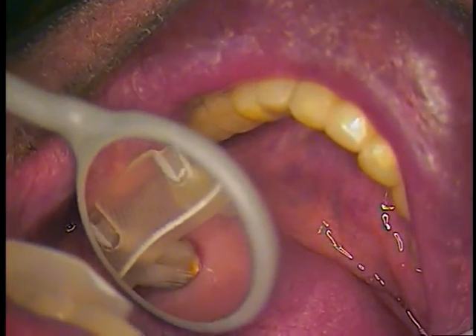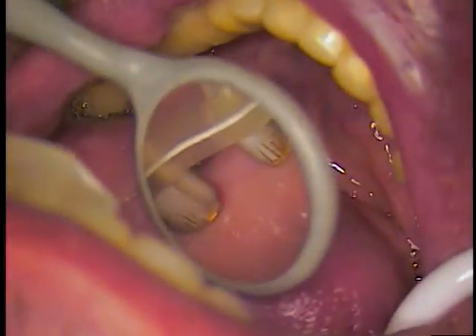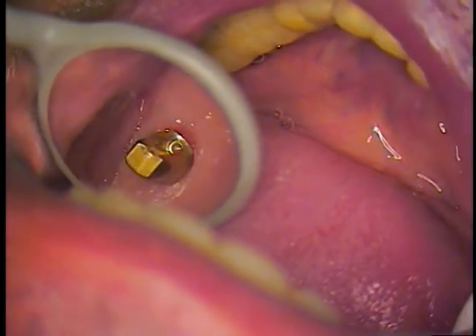We're going to check the soft tissue, checking for any blanching. Looking underneath, checking the lingual. You can see there's a little bit of tissue irritation on one of the two abutments — that's because we actually pulled the design further back distally. So the healing of the gingival former formed a little area, a natural area. When we deviate a little bit from that to make the design right for this case, that's what that is — not really an irritation caused by neglect of any type.